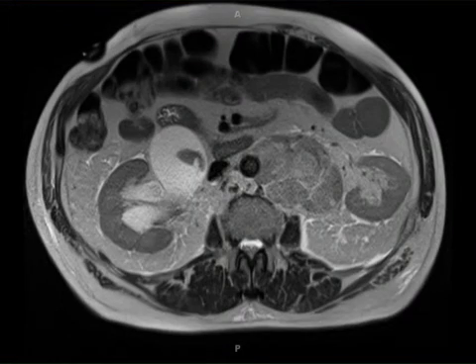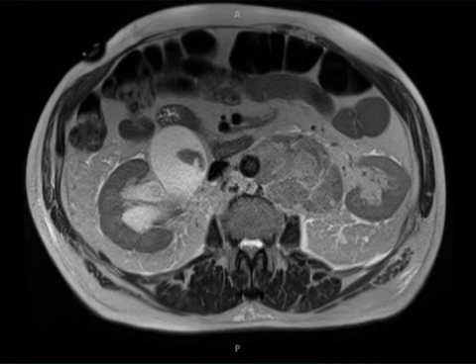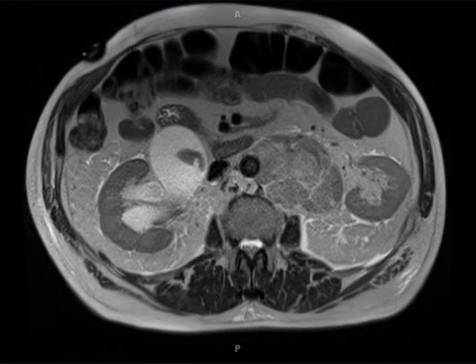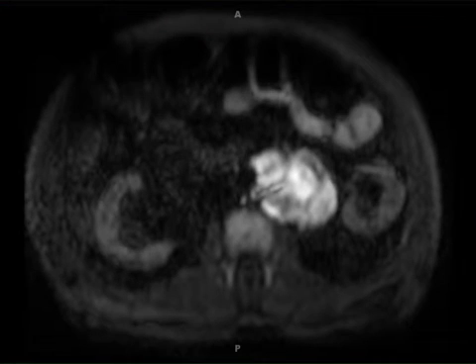These images demonstrate a solid-appearing T1 iso-intense, T2 mildly hyper-intense, mildly enhancing lesion with few enhancing vessels. The lesion demonstrates lobulations and prominent diffusion restriction.